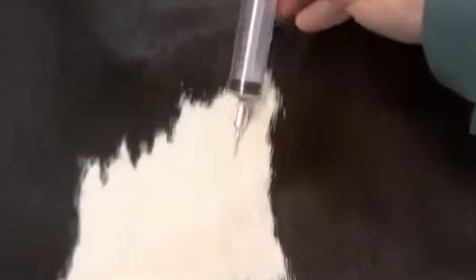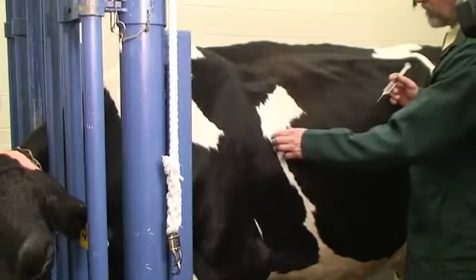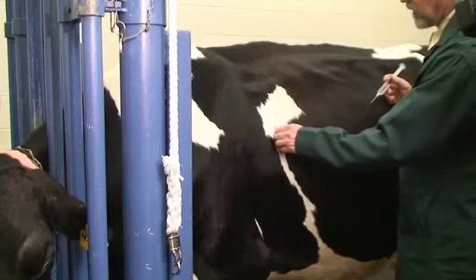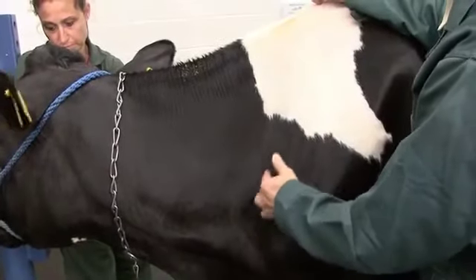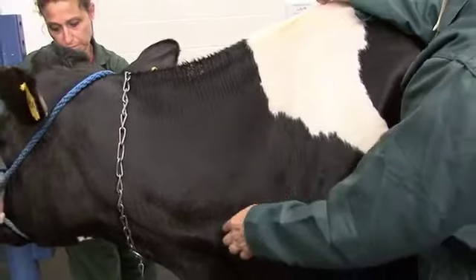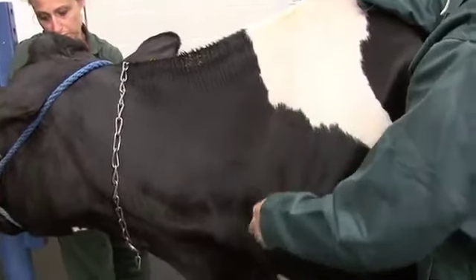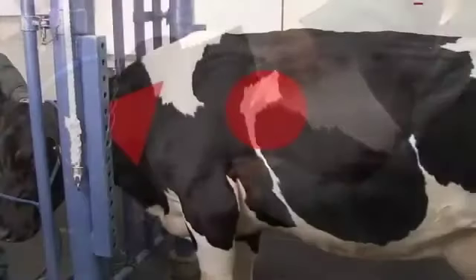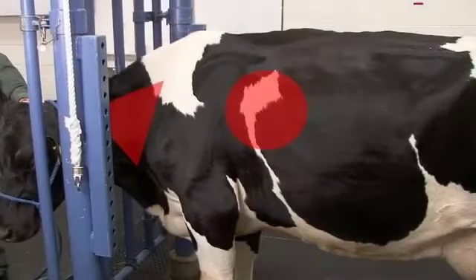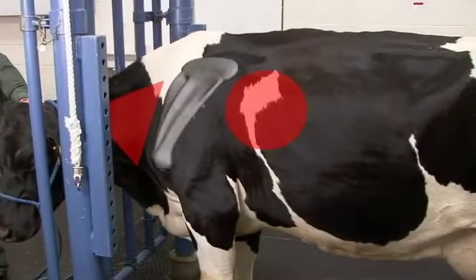Subcutaneous injections can be given in one of two locations: caudal to the forelimb at the level of the mid-thorax, and cranial to the forelimb in the caudal cervical region. Both locations have ample loose skin that can easily be grasped for the injection. However, care must be taken to avoid hitting the scapula with the needle.